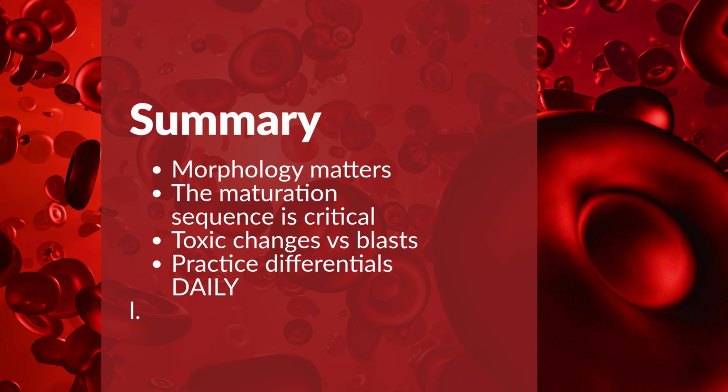Toxic changes versus blasts. Learn the difference. Toxic changes usually indicate infection and an active marrow response. Blasts indicate immature malignant cells and possible leukemias. Do not confuse reactive changes with malignancies.